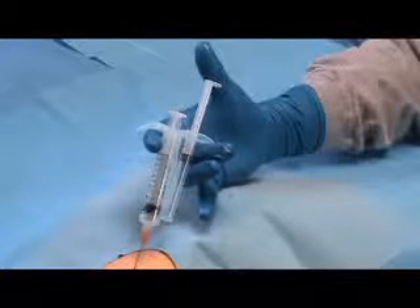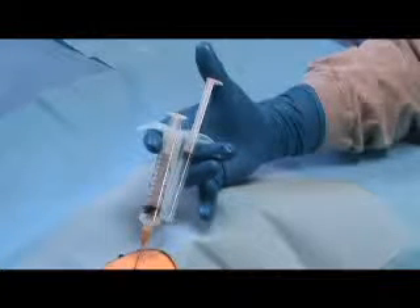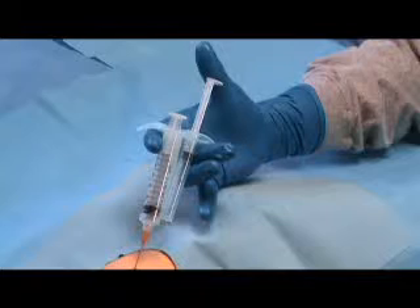The aspiration plunger is released prior to extracting the needle to release the vacuum, and to prevent the sample from being aspirated into the barrel of the RPD.